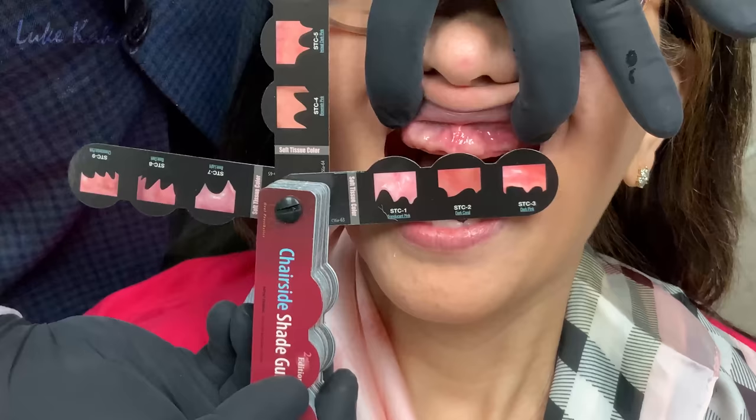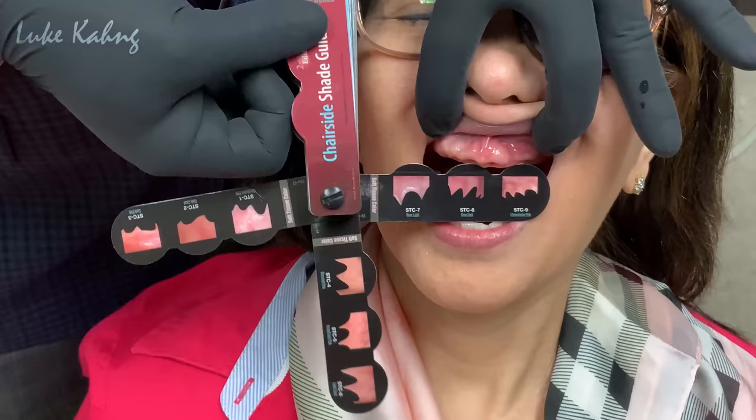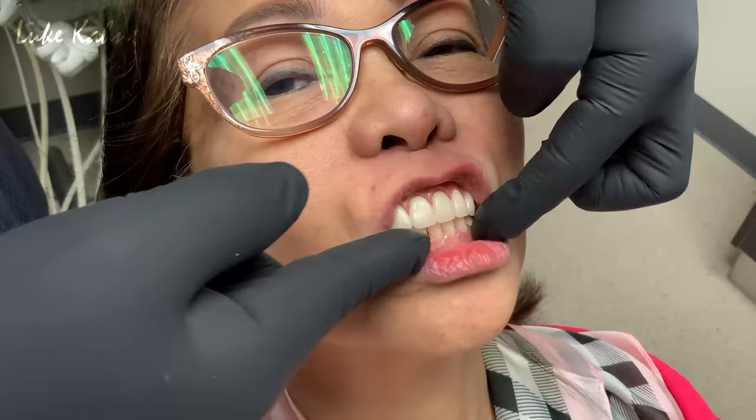Then I'll switch over and run it like this and compare it. And then I'll come back to the last one, switch over and compare it. So it says there, that's pretty close right there, ST8, ST9. See? So that's where I'll take a picture and I'll let Luke know that that's the gum shade we want. See? So that's a nice A1.